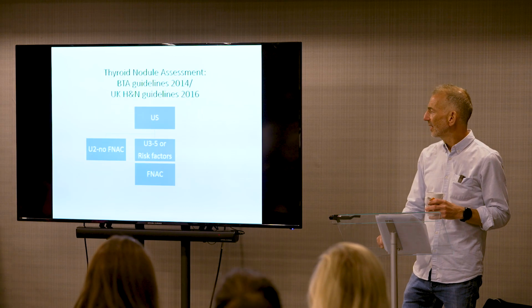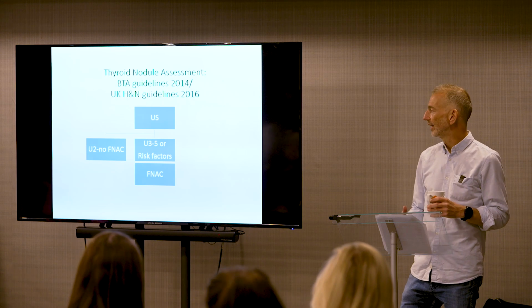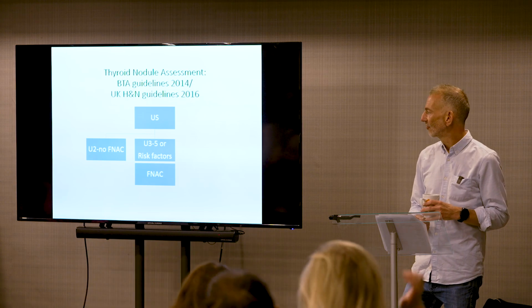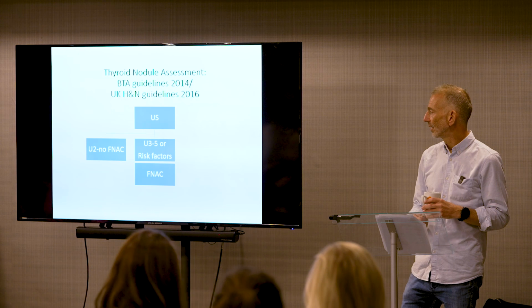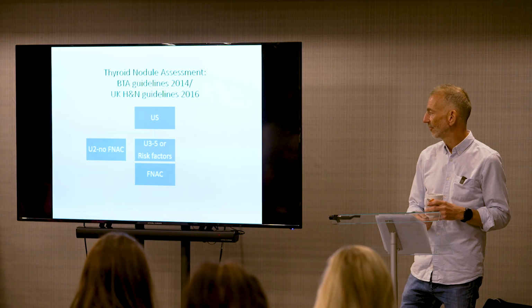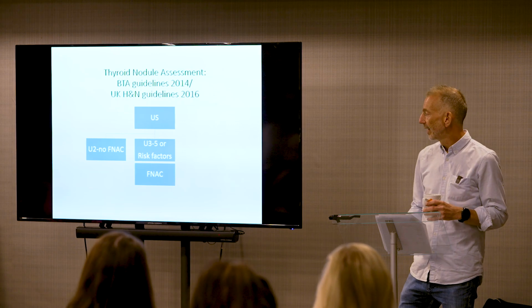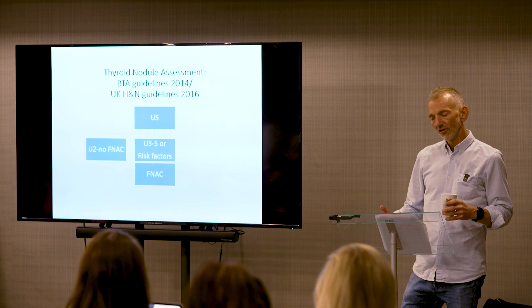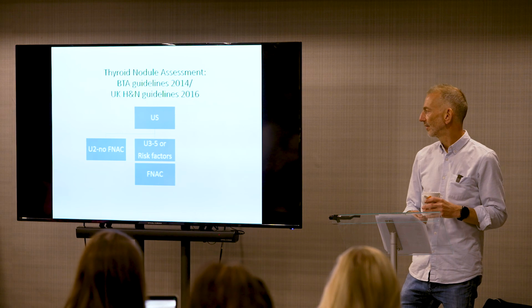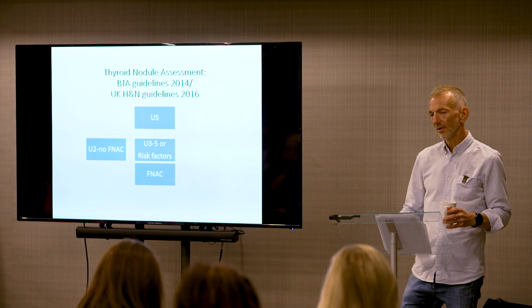So there's been a little bit of change in thyroid nodule assessment. What we've had since 2014, the BTA guidance, is the description and popularization of the U classification, ultrasound classification, BTA U classification for thyroid nodules. And essentially you perform an ultrasound scan of the thyroid nodule. If it looks benign, which is U2, and that will be explained by Veena shortly, it's benign, no FNAC is required, end of story.